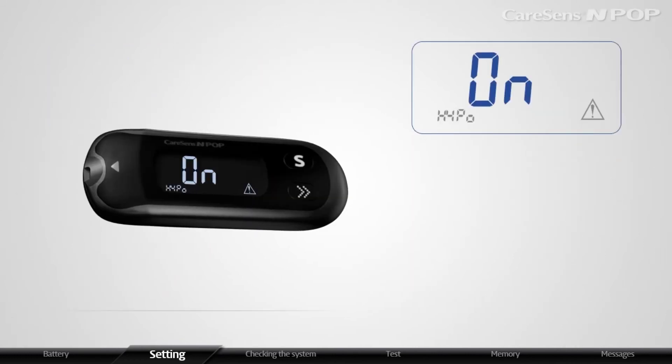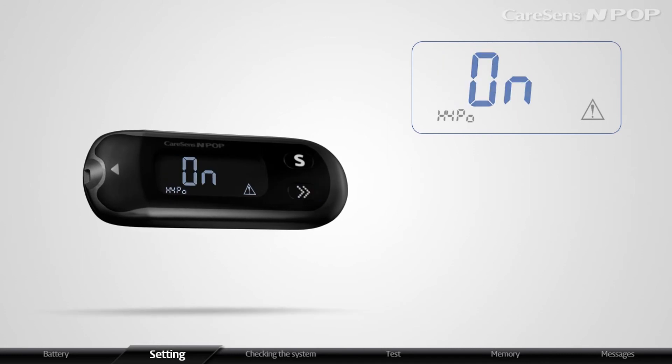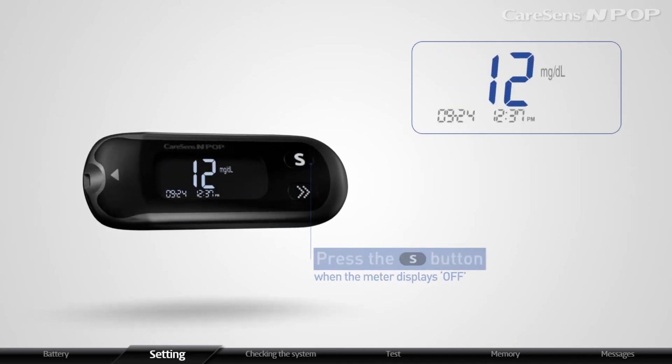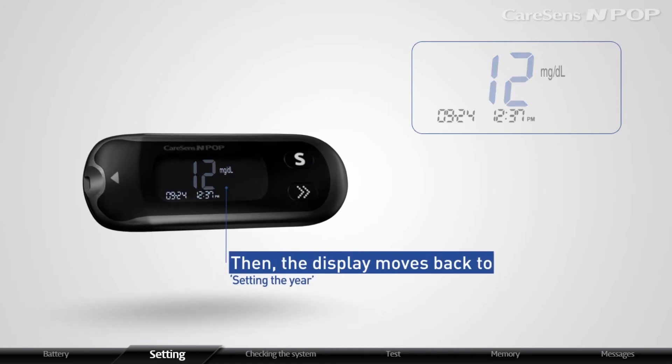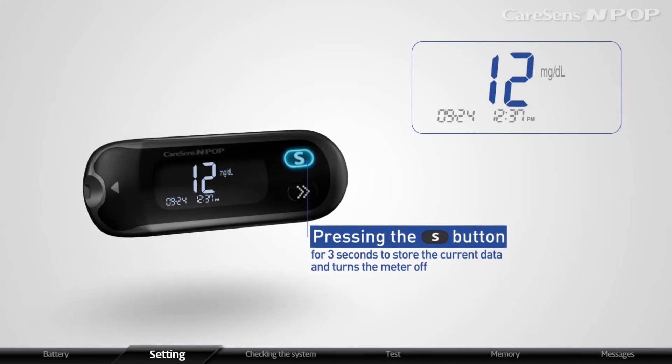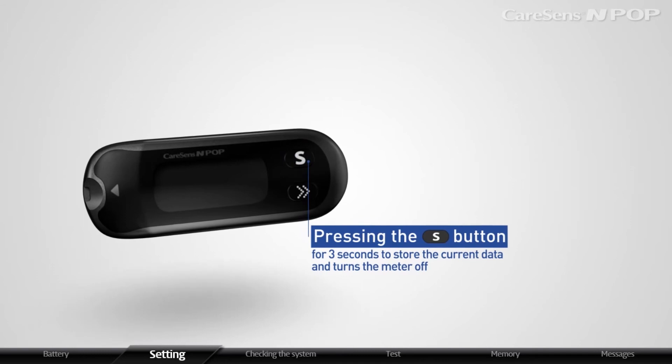If you do not want to set the hypoglycemia indicator function, press the S button when the meter display is off. Then the display moves back to setting the year. In all setting modes, pressing the S button for 3 seconds designates the meter to store the current data and turns the meter off.